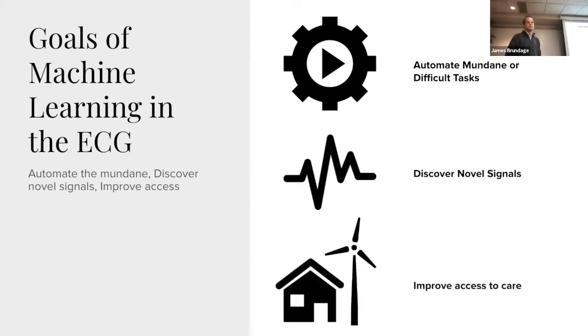And then finally, it's developing tools like this and then allowing those to improve access, right? So whether this means that you're in a rural clinic or somewhere that doesn't have access to specialist care, we can deploy a model that's going to let you have some kind of preliminary high-level expert analysis, that's very impactful, especially where the recording hardware is available pretty ubiquitously.